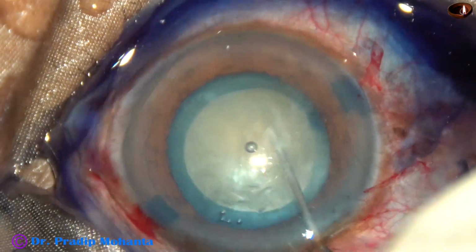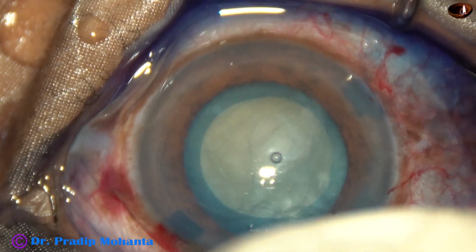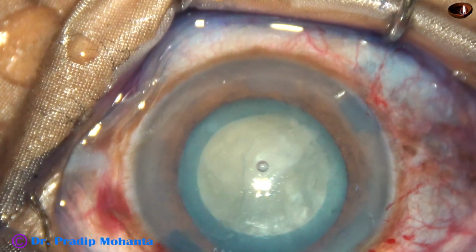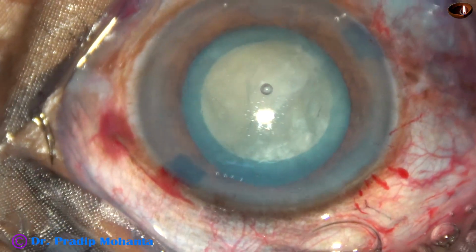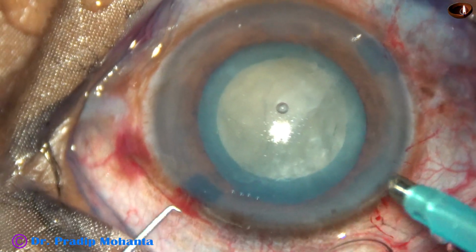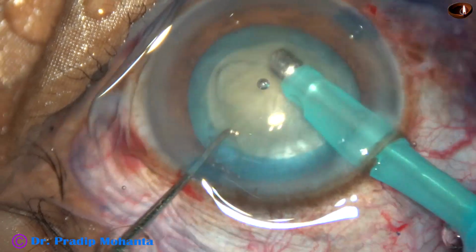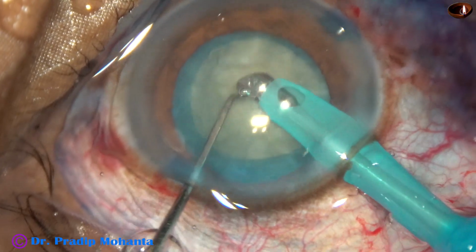And now we can see there is a lot of loose cortex. So within a few days or few weeks, this cataract would have gone into the stage of intumescence. And now the tip of the phaco handpiece is introduced into the anterior chamber with its bevel down. The loose cortical matter is removed, and now the nucleus is rotated nicely.